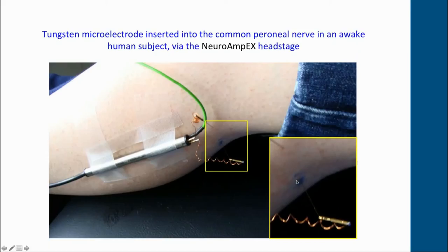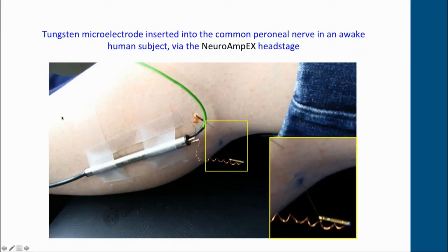We locate the nerve site by using surface stimulation through a one-to-two millimetre surface probe. We deliver cathodal currents of two to ten milliamps, and when we're over the nerve we get twitches of the innervated muscles and/or paraesthesiae — pins and needles — in the innervation territories of cutaneous fascicles. We then mark that site and insert the active recording microelectrode, and into the skin about a centimetre away we insert the inactive or reference electrode.